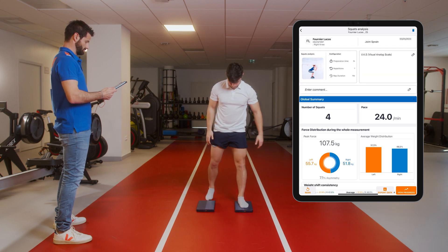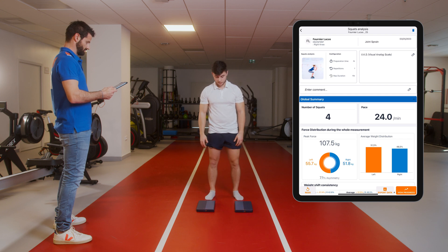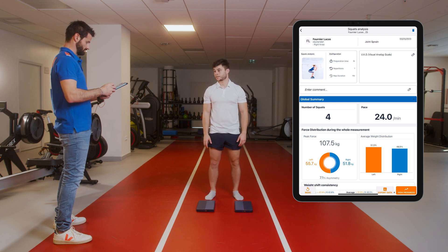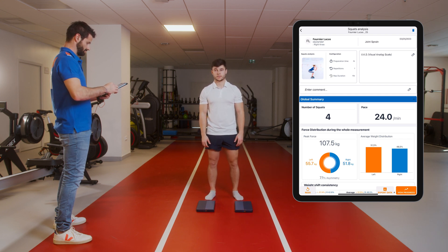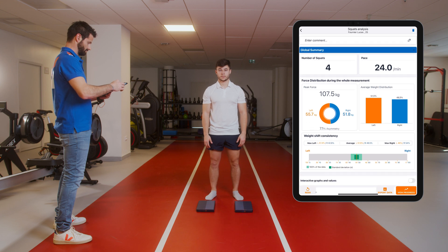Stop. The patient can step off. The track record appears automatically and you will have access to a global summary of the exercise.